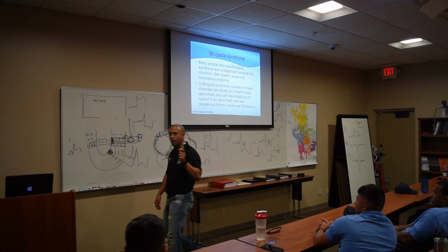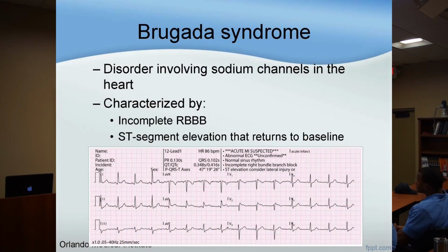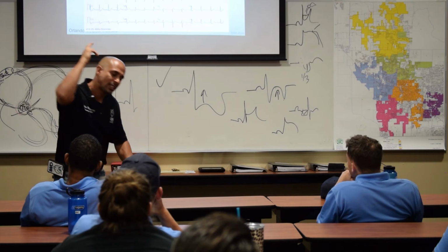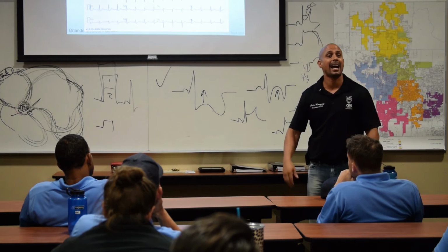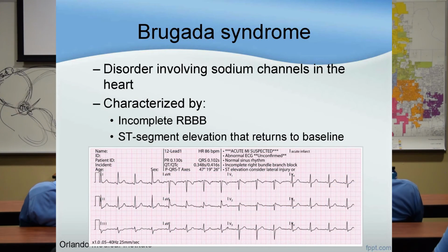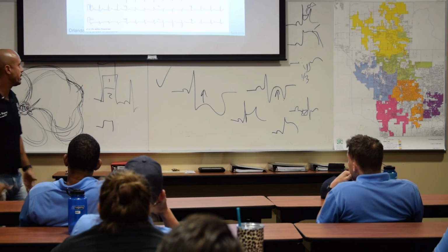You know what's the common problem? A good medic, or even a good doc, might say, oh my God, this guy has Brugada. A syncope episode you can't determine why. What did I tell you to do with syncope episodes? 12 lead. Do a 12 lead. Syncope is the most common presentation of Brugada. If a patient has Brugada, this guy has one foot in the grave and he is slipping on the other. That banana peel, gone. These patients code right into cardiac arrest. They look at their coronary arteries, everything is fine. Clear. Crystal clear, but they died of a heart condition and it's Brugada.